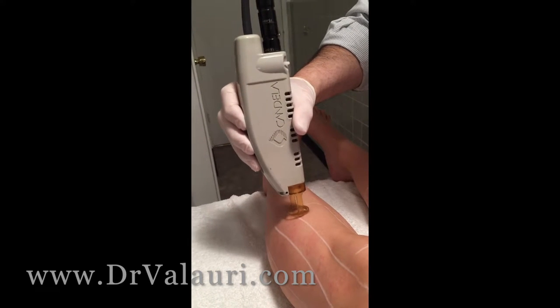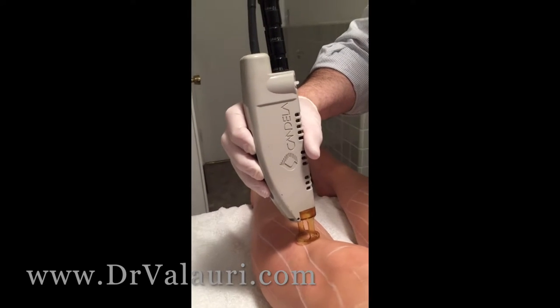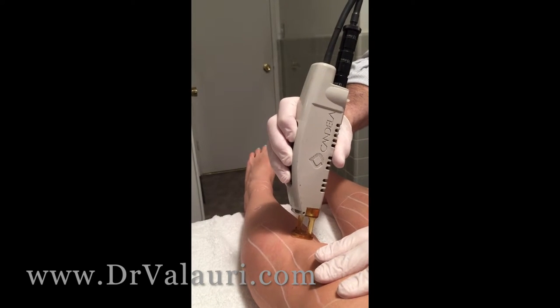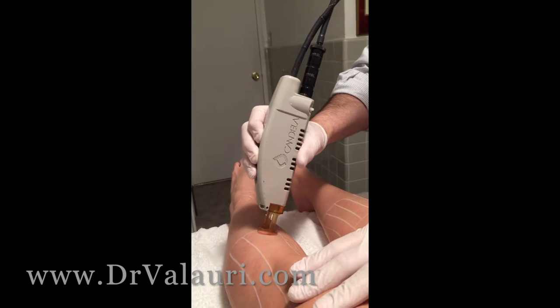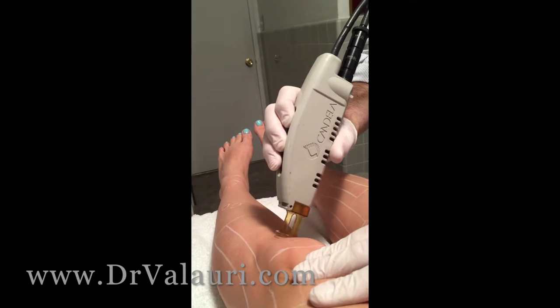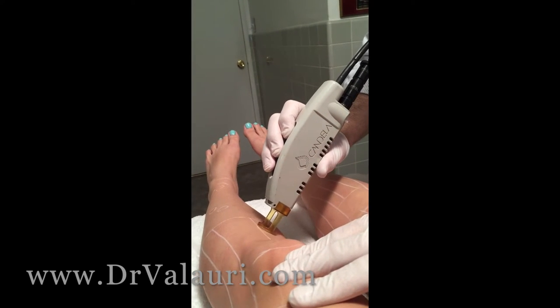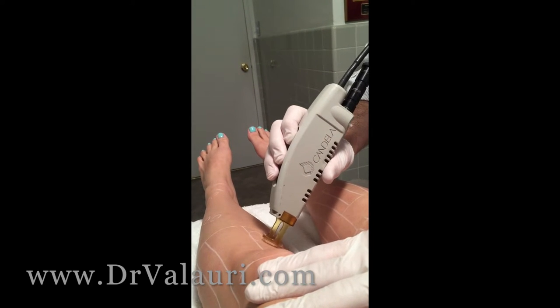We're just doing a little bit of touch-up, some scattered hairs marked, and sometimes it's just easier to do a whole area again. She's been one year and maybe has about 30 or 40 hairs scattered around, so we're just kind of doing a general clean-up of what we call skips, and that's about it.